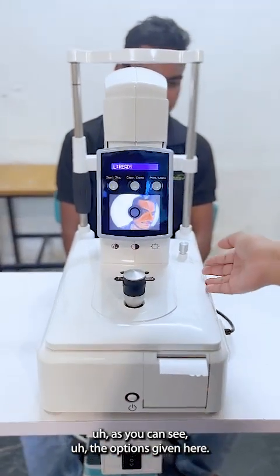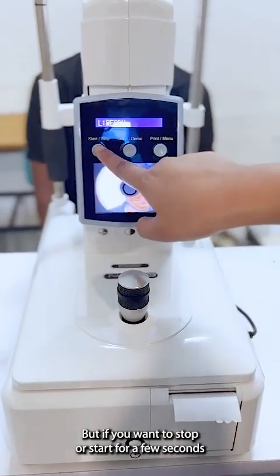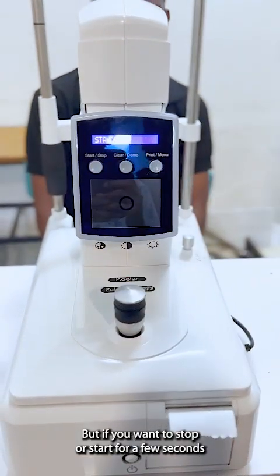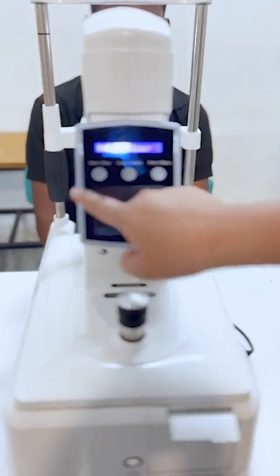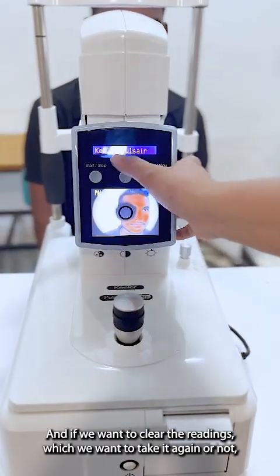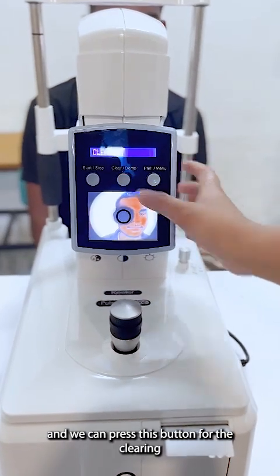The options given here: this is the main button. If you want to stop or start the compressor for a few seconds, we can do that from this button. If we want to clear the readings — to take them again or not — then we can press this button for clearing.